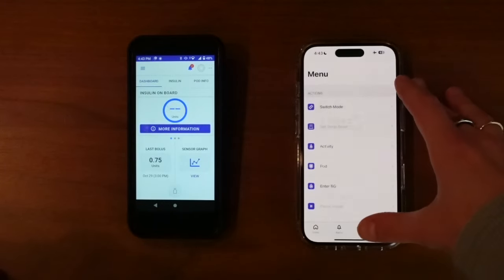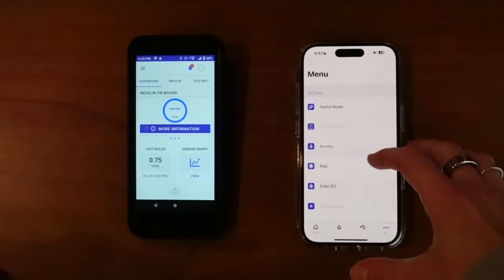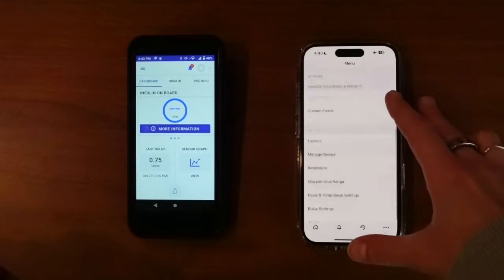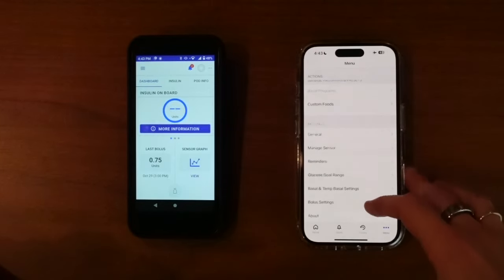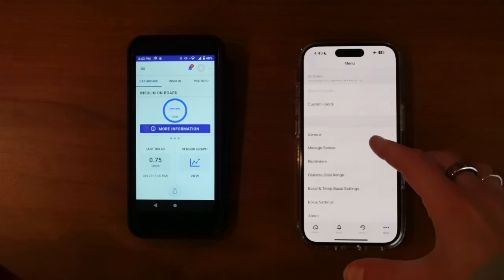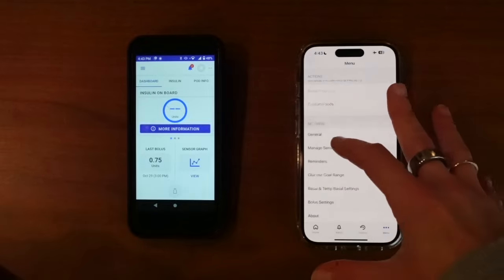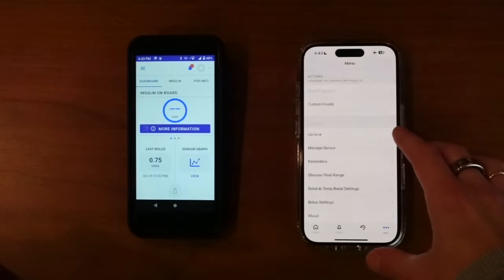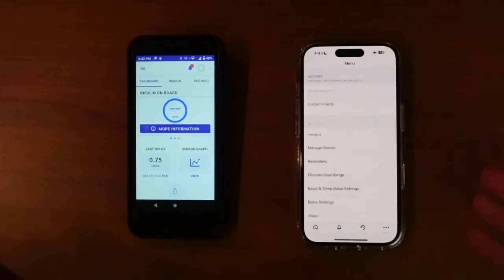It's just very intuitive. You go into the menu — that's where you can switch modes, set a temp basal if you're in manual mode, activity, pod, enter BG, pause insulin. This is where all your settings are going to be, but you're not even going to be able to get to this screen until you do those bulk initial setup settings. So this is where you could add, for example, another basal rate profile and go in and make adjustments.